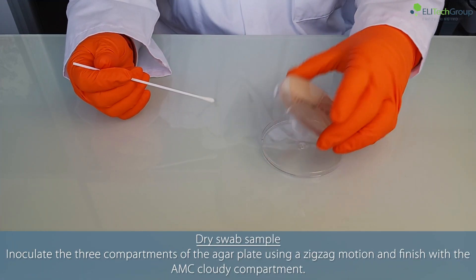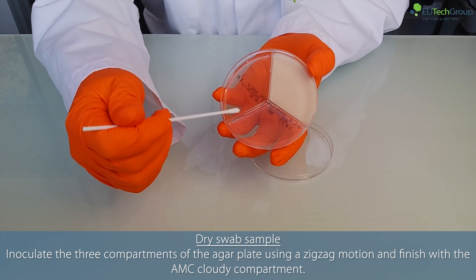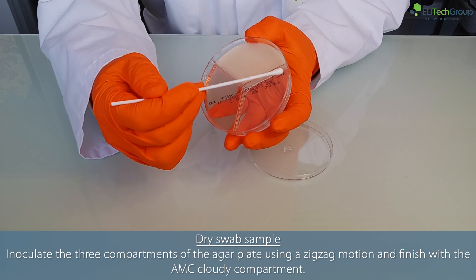For dry swab sample, inoculate the three compartments of the agar plate using a zigzag motion, and finish with the AMC cloudy compartment.